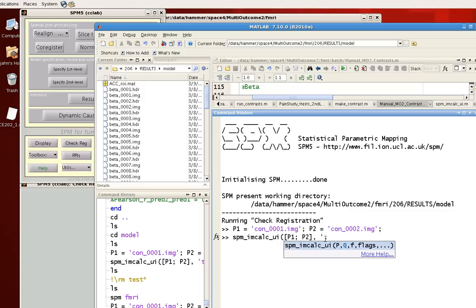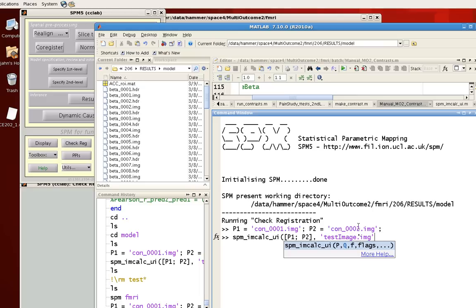And next I'm going to give it an output. So testimage.img. Make sure to include the extension. It caused me a lot of trouble starting out because you'd get an error if you didn't include a .img or .nii extension.